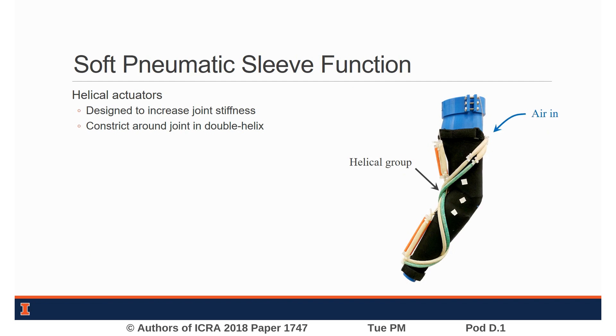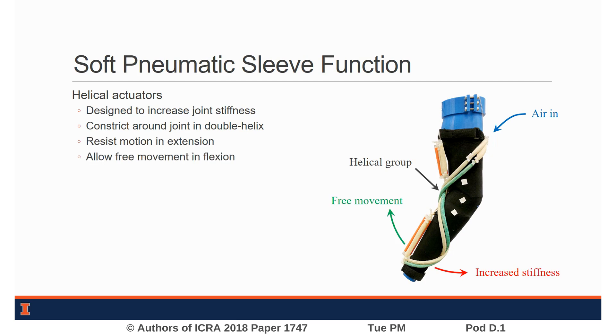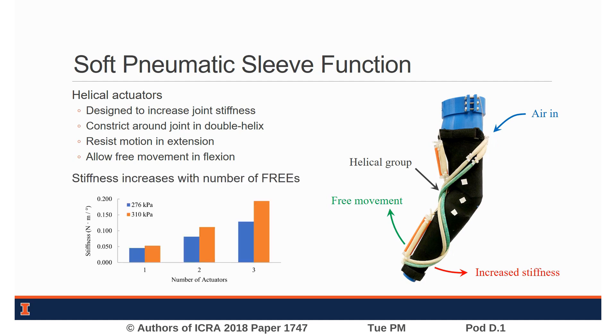When air is supplied to the helical actuators, they contract around the arm in any position and resist movement in extension while allowing free movement in flexion. The helical group can include multiple FREEZ in parallel, and we found that the stiffness from helical actuators increased with the number of actuators and pressure.